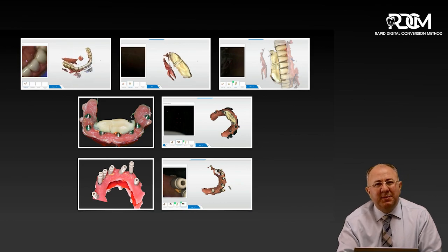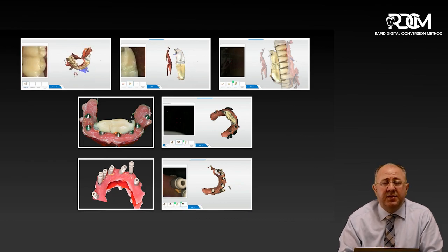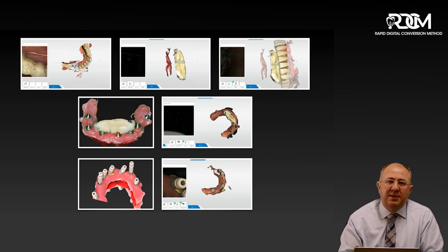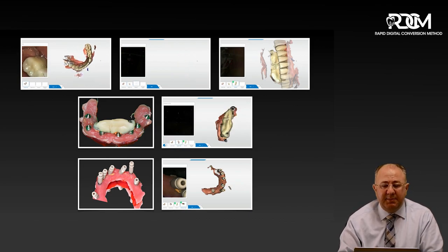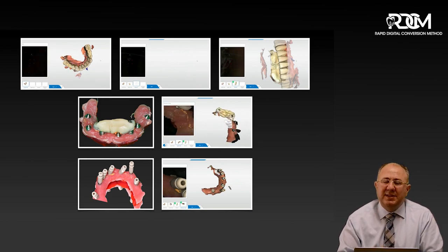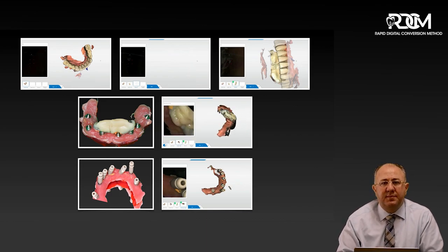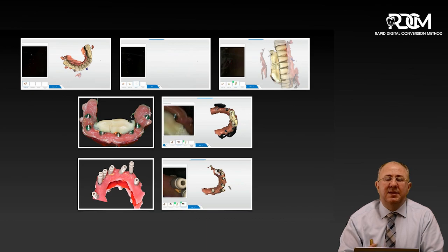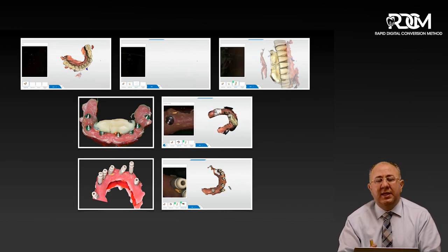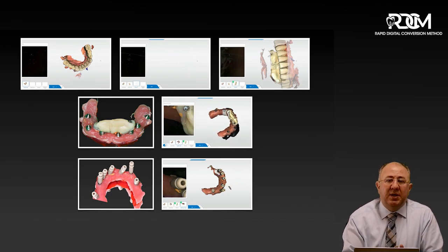The most important step in my method is tricking the scanner into scanning a model in occlusion. To do this, I move the ASA appliance from the patient, install it on the model, go back to the scanner, and ask the scanner to continue the scanning process — finishing the scan that started intraorally now on a model in hand.